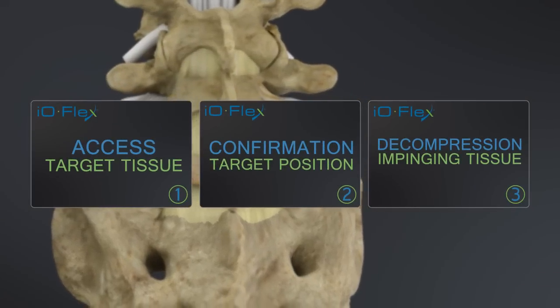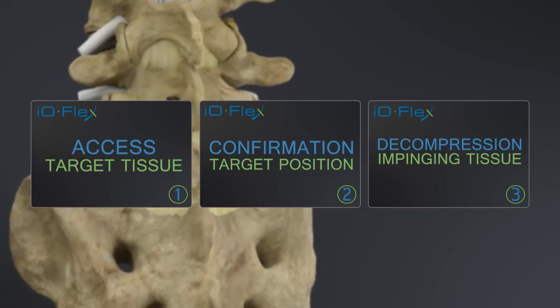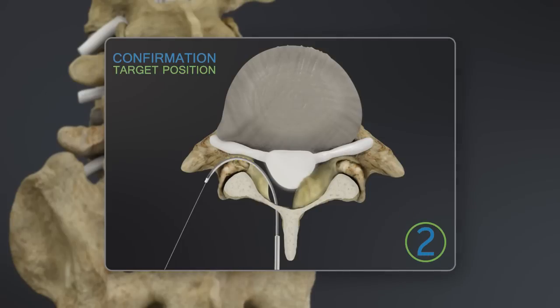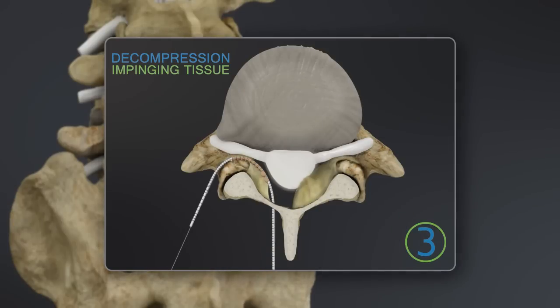Precision decompression using the IOFlex system is done in three simple steps: one, access; two, confirmation; and three, decompression.